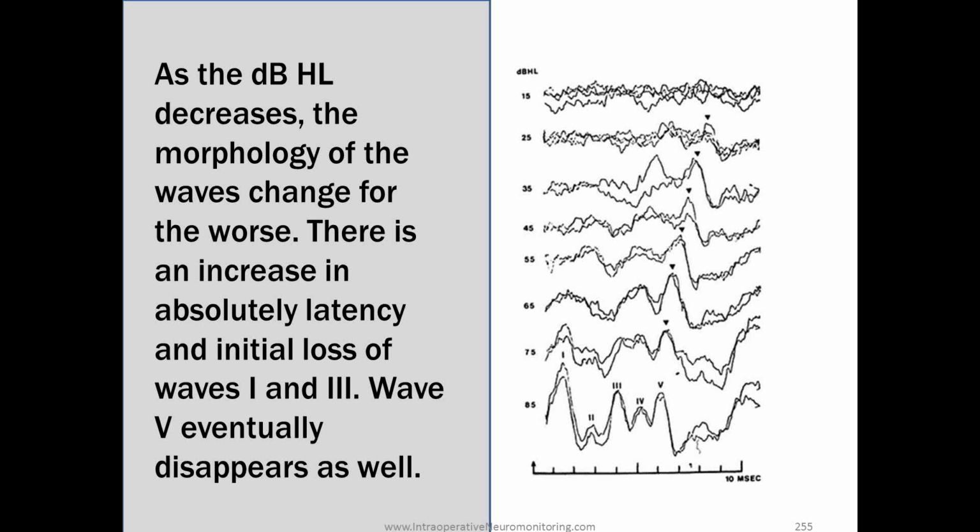So this is what I was speaking to before about when we're trying to separate wave 4 and 5, we can use this. Right around, say, 45, we see wave 4 is gone. We crank it up to 55. Okay, we're still tracking back with wave 5, and then we could easily keep our marker there on wave 5.